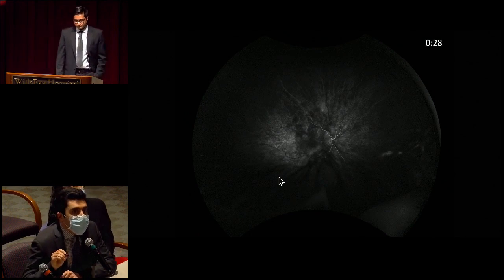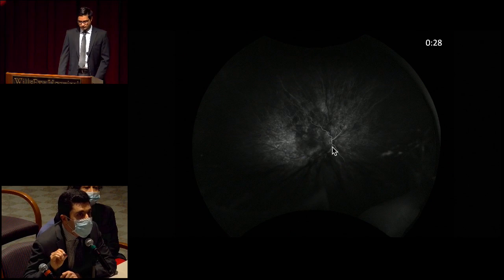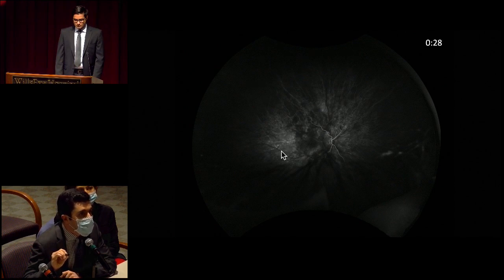We have some fluoresceins. So fluorescein angiogram wide field of the right eye, 28 seconds. We appear to be in the arterial phase, relatively good filling so far. We do appreciate the tortuosity in the arteries, as we noted previously. In regards to the overall choroidal perfusion, it does appear somewhat patchy. We are fairly early, so we'll see how that lights up later on. And we're starting to get these foci of hyperfluorescence, which appear to be, at this stage, probably deep and localized to the choroid in the temporal macula.